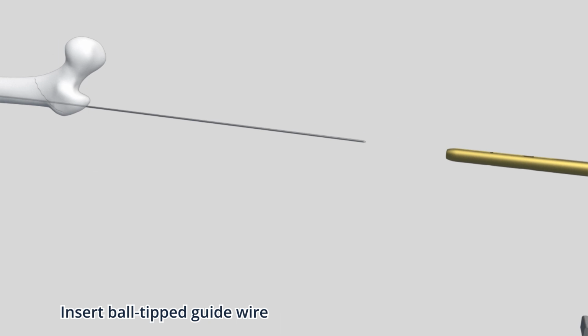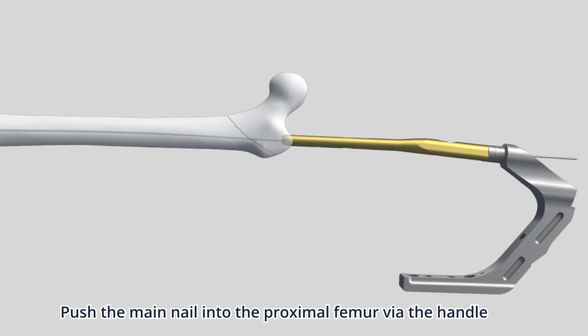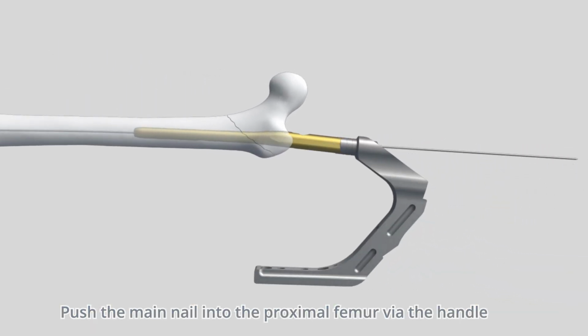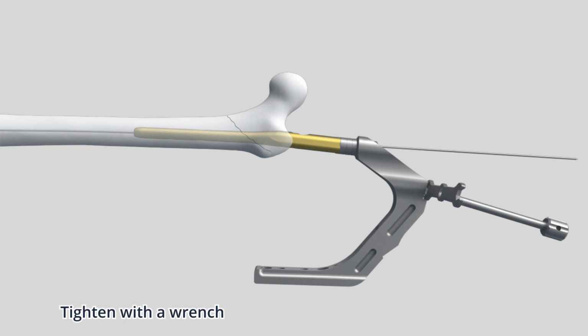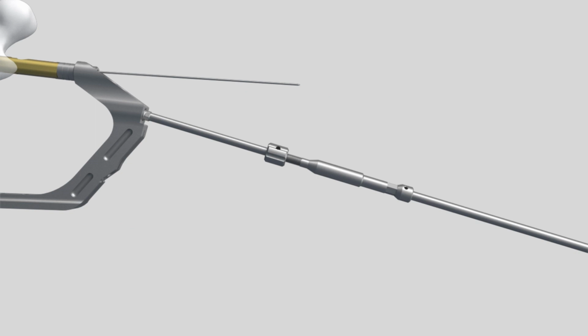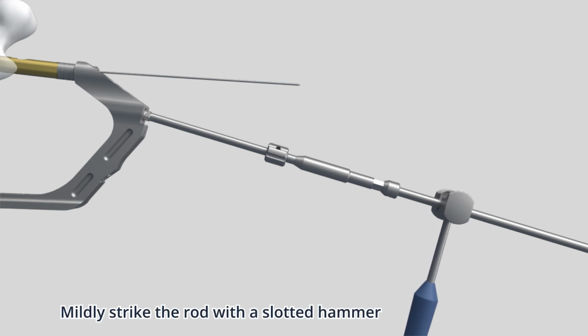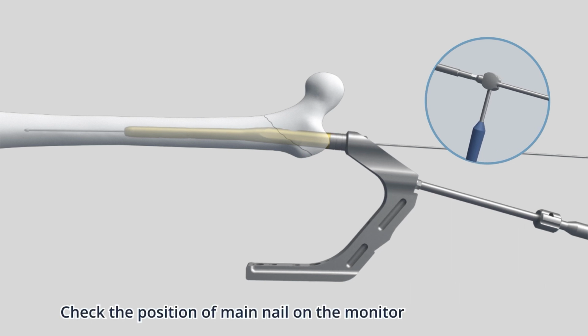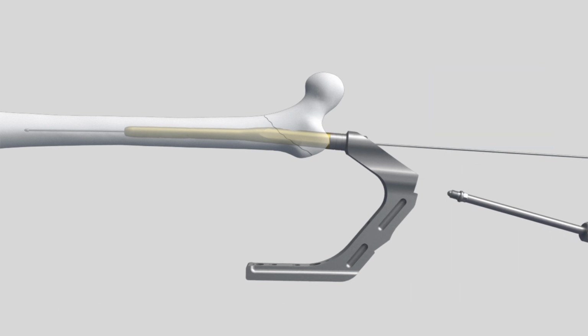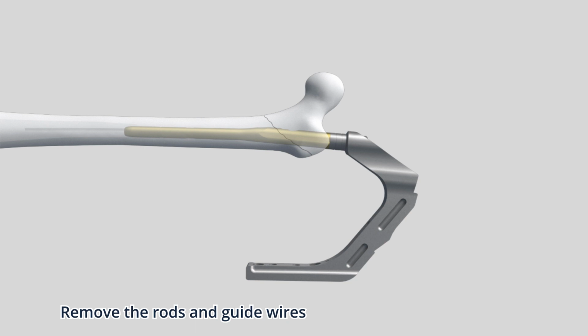Insert ball-tipped guide wire. Push the main nail into the proximal femur via the handle. Adjust the obliquity angle of femur, then install the strike rod onto the handle. Tighten with a wrench. Install extracting rod. Mildly strike the rod with a slotted hammer in order to insert the nail. Check the position of main nail on the monitor. Remove the rods and guide wires.